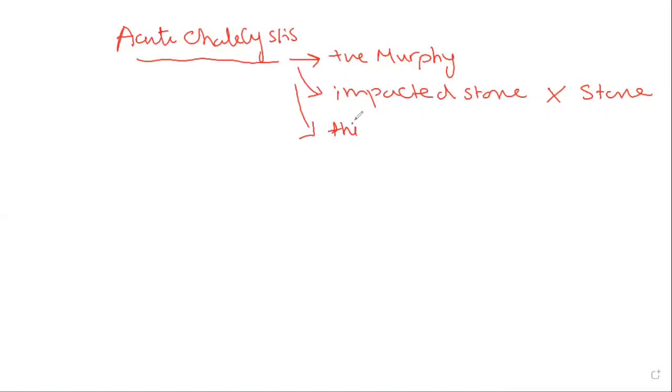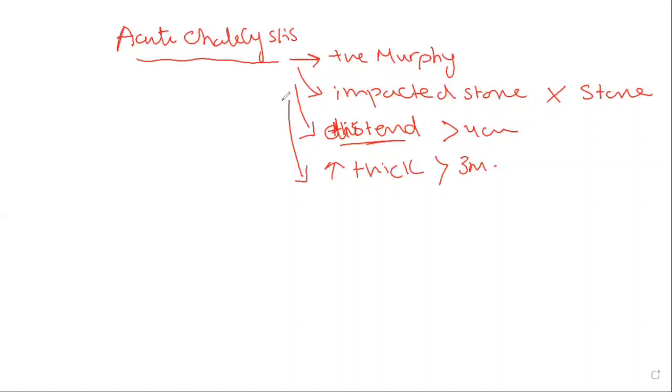And then let's remember together what will happen. The gallbladder will distend. Being obstructed, it will distend more than 4 centimeters in width. And then the wall would do what? It will hypertrophy. So I have thickening of the gallbladder wall more than 3 millimeters. And then this thick wall would call for more blood supply. That is hypervascularity. And then this would ooze and leak around it, causing pericholecystic fluid. Now let's count: 1, 2, 3, 4, 5, and 6. Voila.